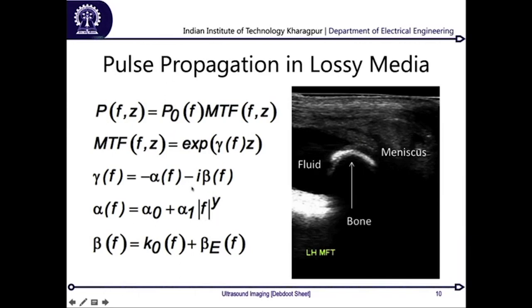This is what it signifies. Now, if we look through this whole cumulative set of equations along with alpha and beta, you would see one particular thing: at the same depth, if you have a higher frequency, you have a larger attenuation. So it is always very profitable to run at a lower frequency, right? But is that always a very good idea? If that is so, then let us run it. If I just want to use the best of the ultrasound frequency, let me use 21,000 hertz or 21 kilohertz, the first ultrasound frequency.